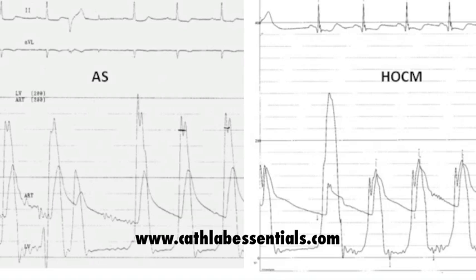The size of the gradient is irrelevant, but the characterization of outflow tract obstruction being of a dynamic type is shown by this beat. Otherwise, the outflow tract would have a fixed component and the slope of aortic pressure would be delayed.